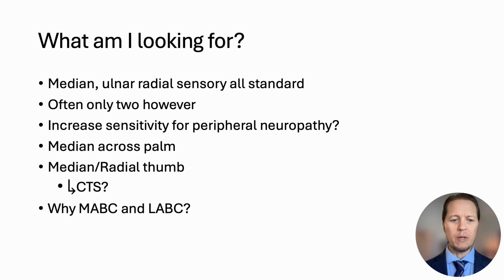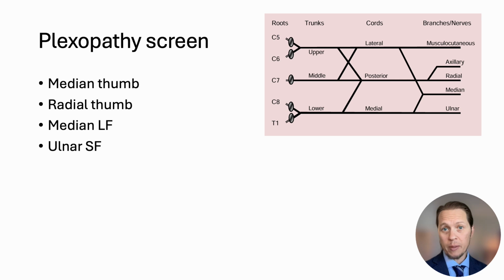But throwing in the other ones, medial and lateral antebrachial cutaneous sensory, when do we do that? That should also trigger an idea of, yeah, plexopathy. So we already have three things that we could be looking for in this case. Let's talk a little bit about plexopathy.